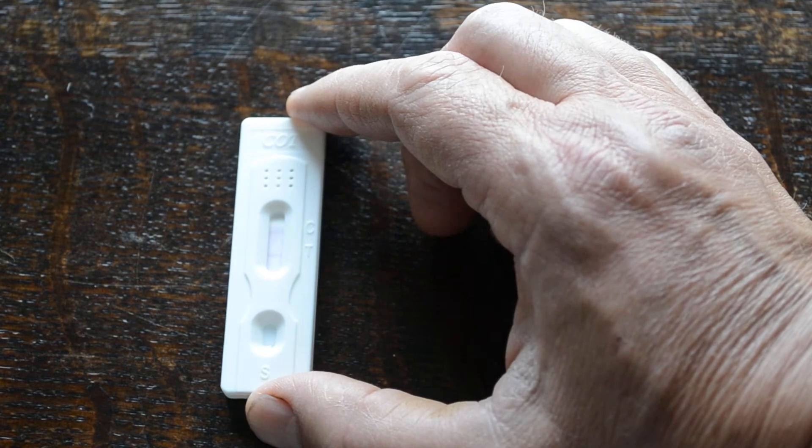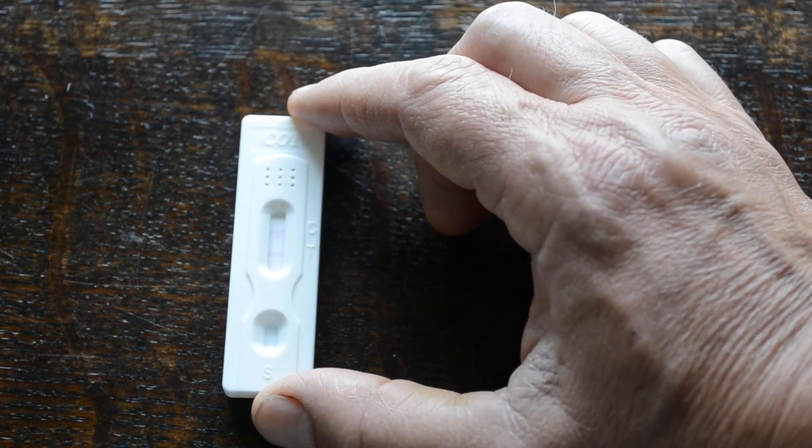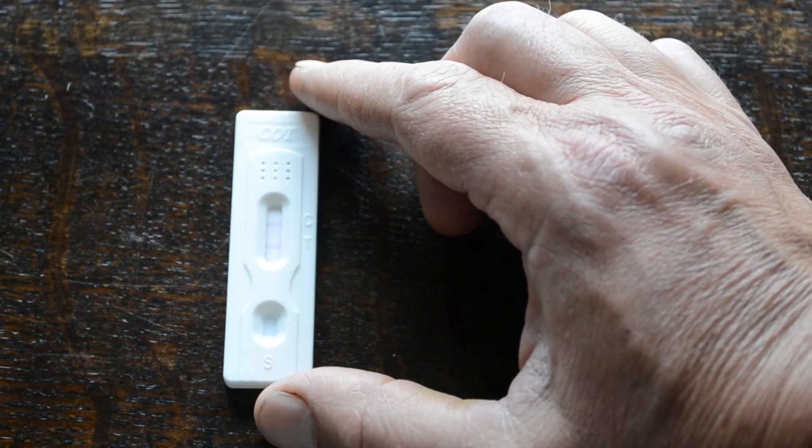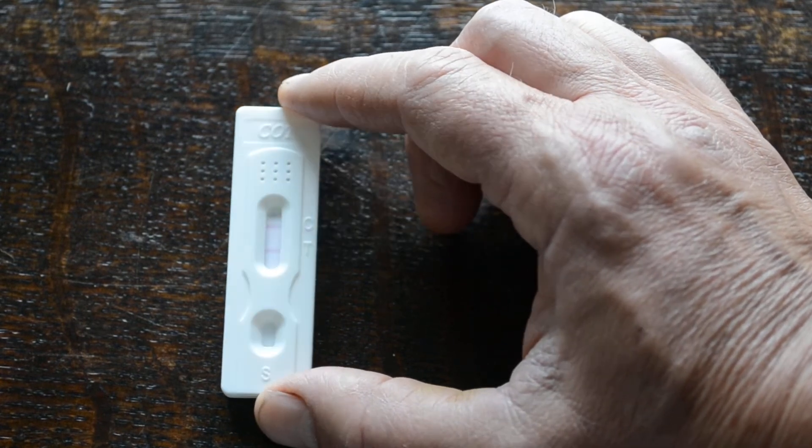If there is cotinine in the sample above 200 nanograms, you will get no test line forming at 5 to 10 minutes, just a clear control line.